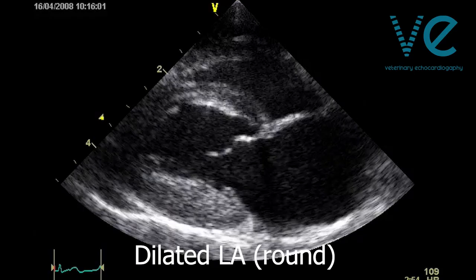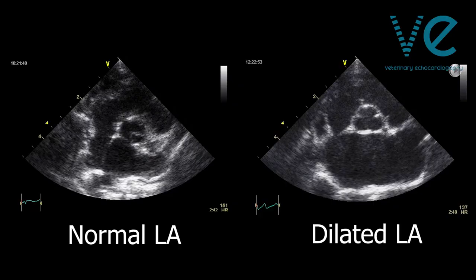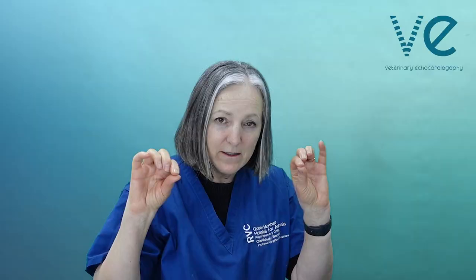In the long axis view, the left atrium will tend to be round instead of square. Even the shape of the left atrial appendage in the right parasternal short axis view can be helpful — it tends to be bigger instead of just a narrow crescent sort of shape.